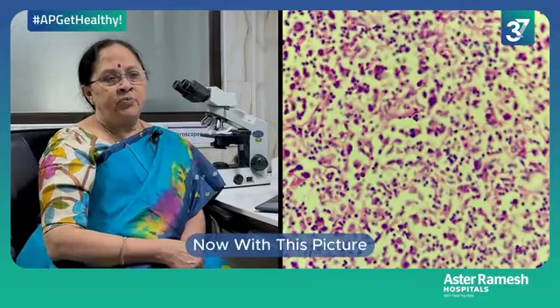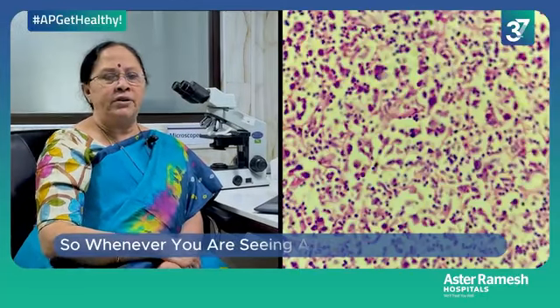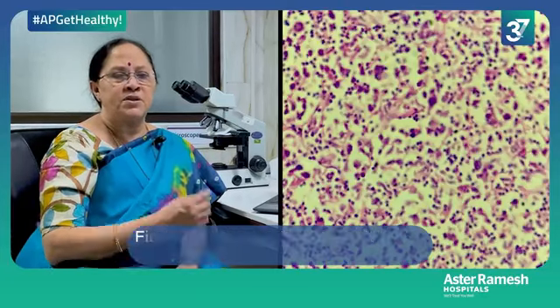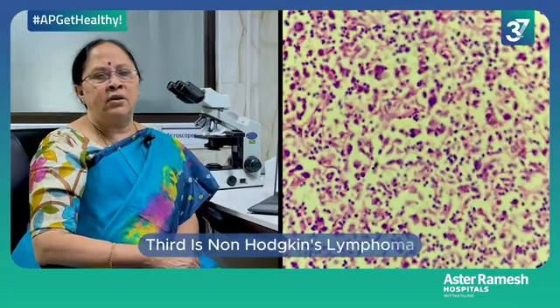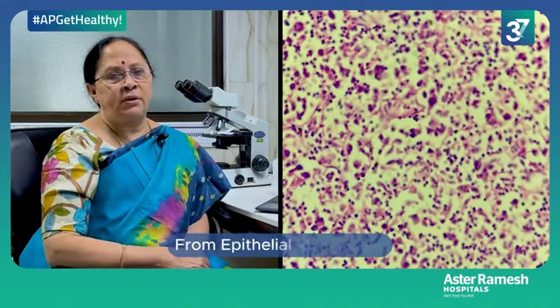Now, with this picture, what are the possible differential diagnoses we can think of? Whenever you are seeing a lymph node neoplastic pathology, the differential diagnosis first is a secondary deposit from epithelial malignancy, then the second is Hodgkin's lymphoma, third is non-Hodgkin's lymphoma. So, first we talk about secondary deposit from epithelial malignancy.